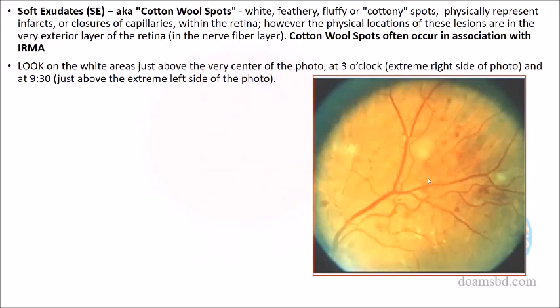You are seeing some new vascularization appearance, right? The vessels are intertwined with each other. It could be IRMA. But new vascularization also appears. So there is a minute difference. I will tell you how to tell whether this is new vascularization or IRMA.